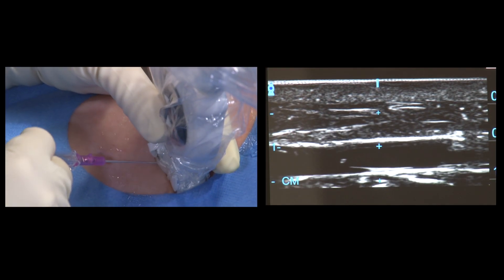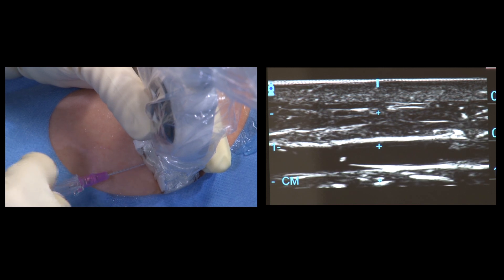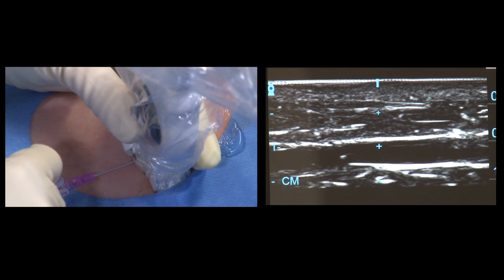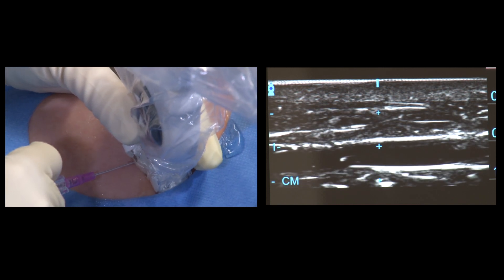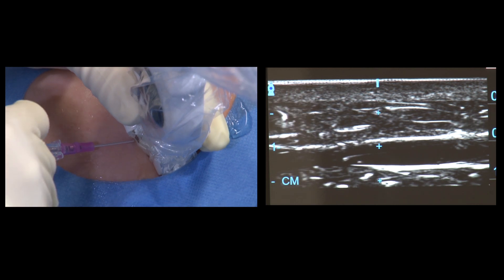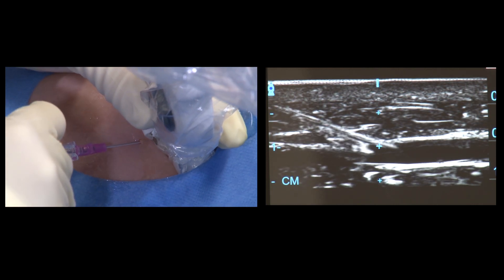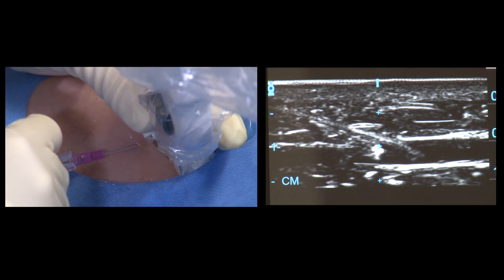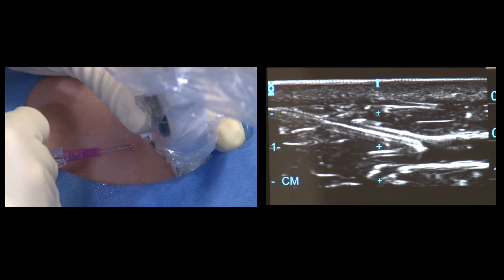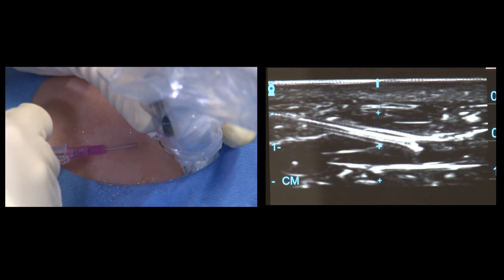Next, access to the vessel is obtained under ultrasound using a modified Seldinger technique. On the left of the screen, we are using an out-of-plane technique, and on the right, for demonstration purposes, you can see an in-plane approach. You can use either.